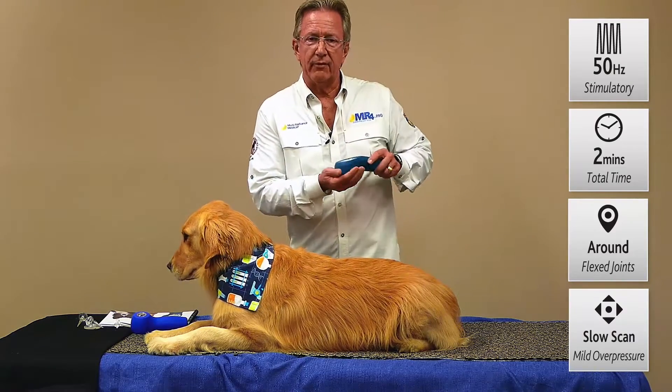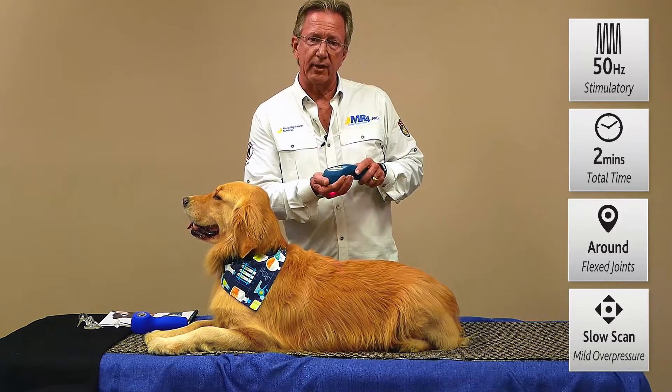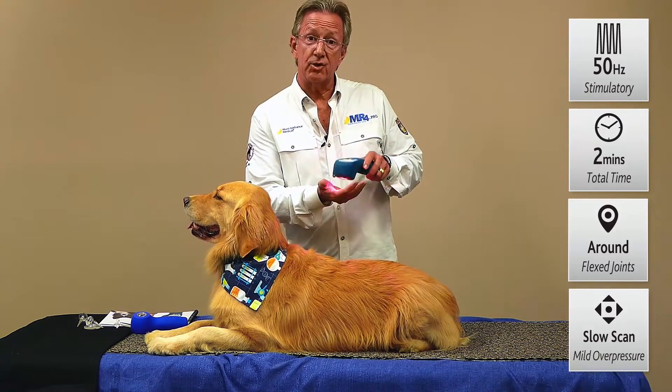Again you're seeing the visible red — the 640 visible red wavelength — and then also the 875 broadband and the 905 super pulse laser. These are all working very synergistically together.